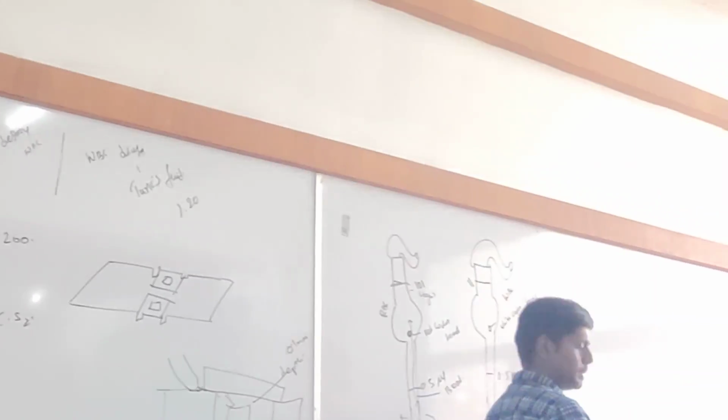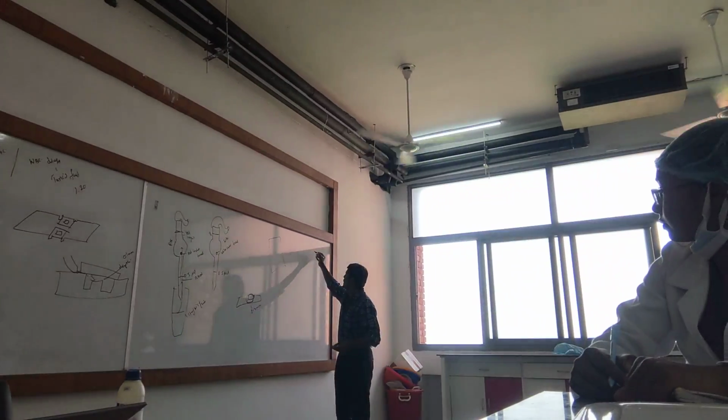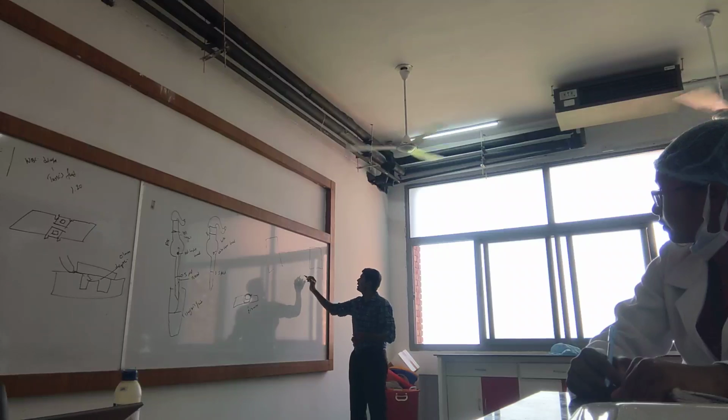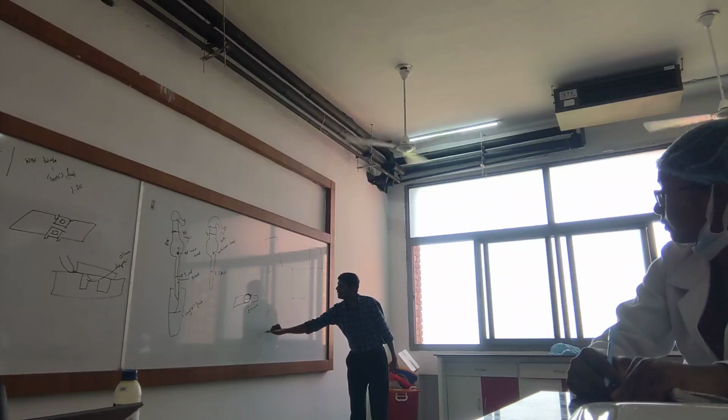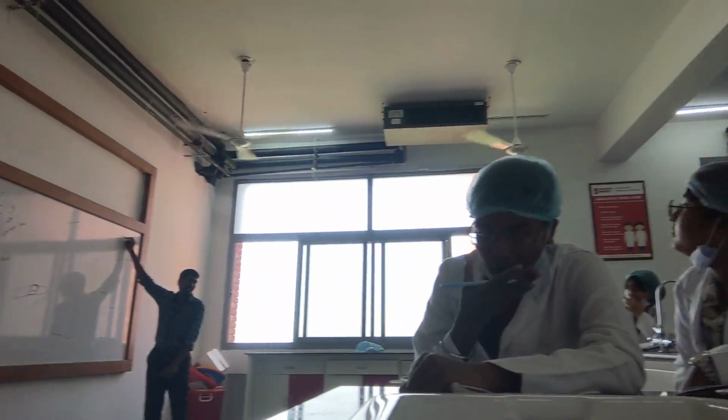So how will you count? Listen. You will draw 5 squares like this on a piece of paper. And how are these squares further divided? 4 into 4. Yes. So this is actually a very lengthy procedure. See what happens.